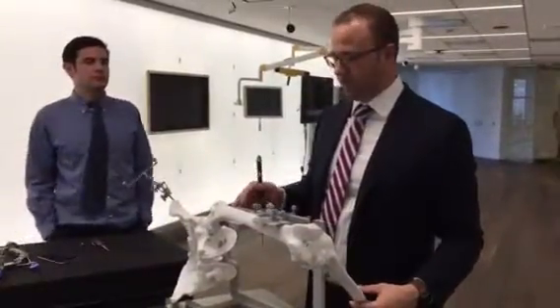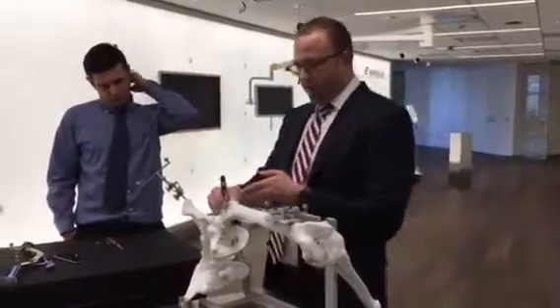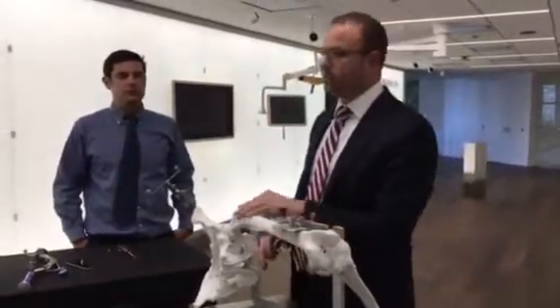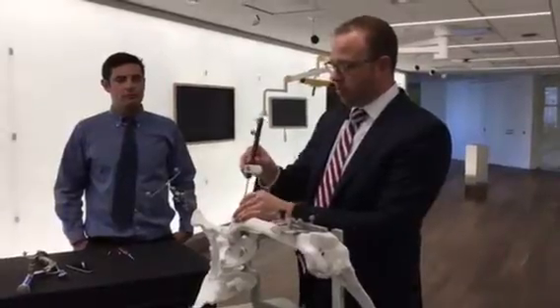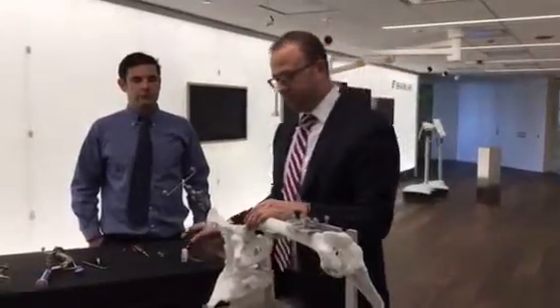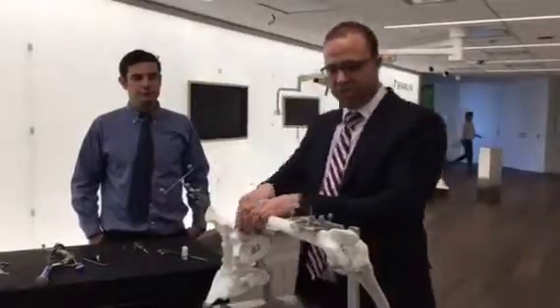And in this portion of the software, we're going to make a leg length measurement, right? And the software is reproducible of the leg length because we take a point at the greater troch. So there's an option to put a screw in the greater troch as it indicates on the screen, and that's just a place where you can put your pointer so you can take your pre-op measurement of the leg situation. Now that I've done that, I can go ahead and remove the femoral head, start doing the procedure.